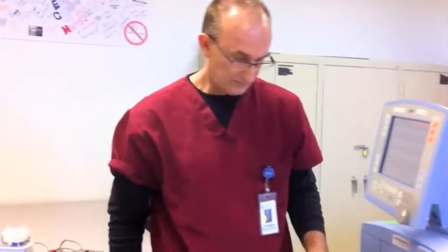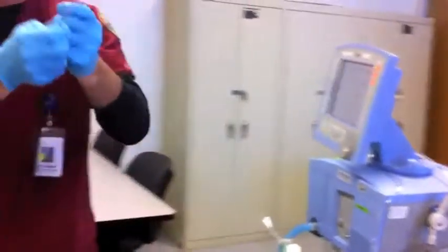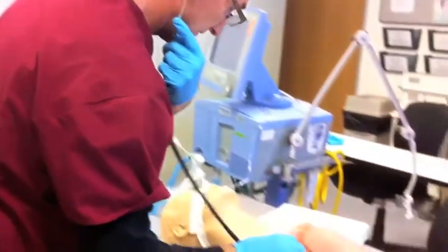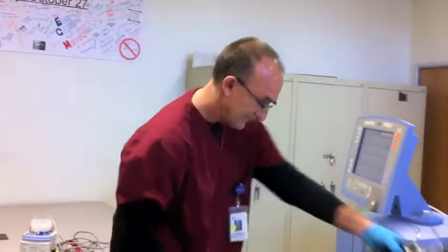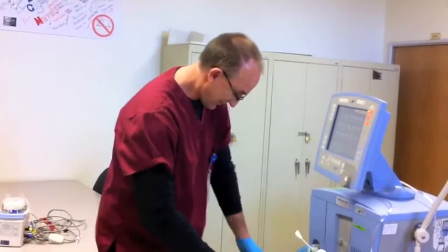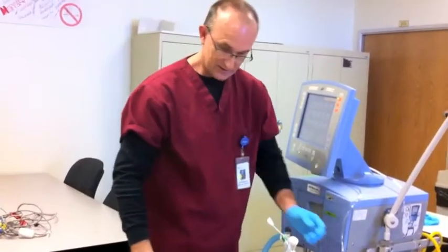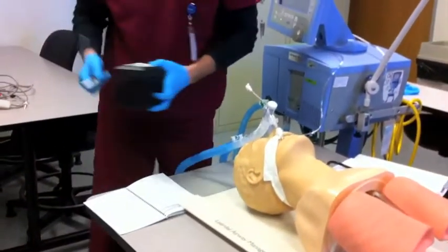Once the treatment is done, he's going to reassess the patient. He's going to check that all the circuit connections are tight and make sure the patient is comfortable. Everything looks good, so he's going to clean up the area.